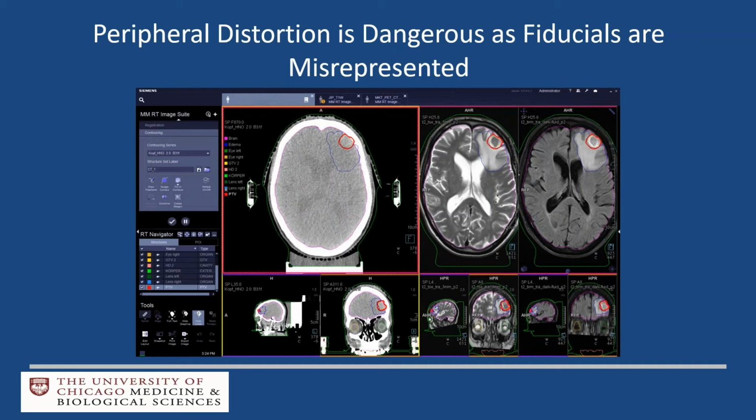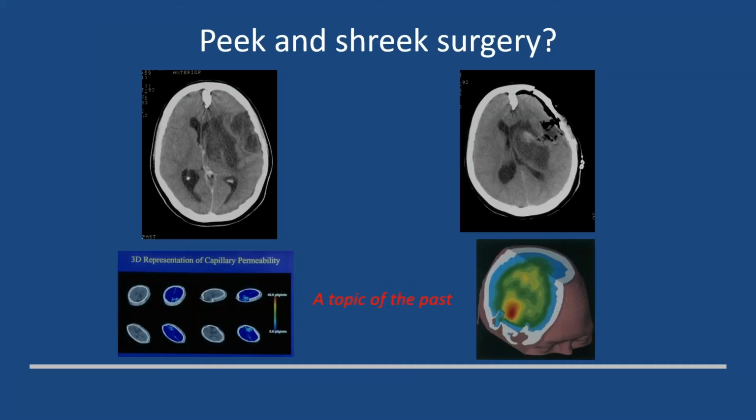planning, we took the same field of view, segmented the volume, and then without transforming or fusing the MR to the CT, just put them on the different scans. And you can see on the right on the MR, you're clearly within the parenchyma, whereas actually on the CT scan, which is the precise orthogonal image, you are already in the bone, which makes a difference if we are aiming at peripheral targets.